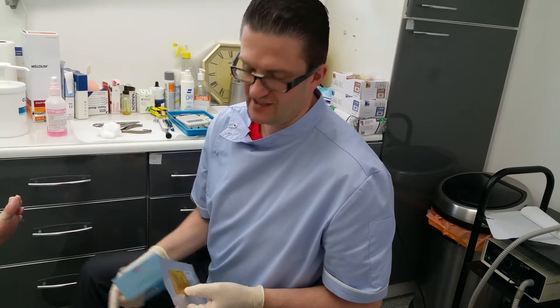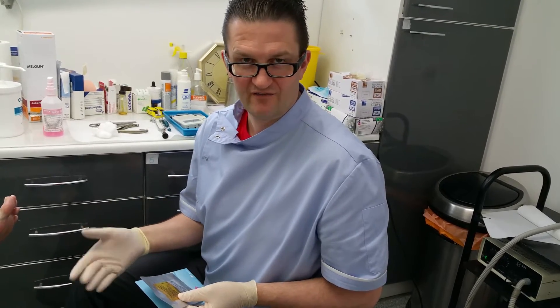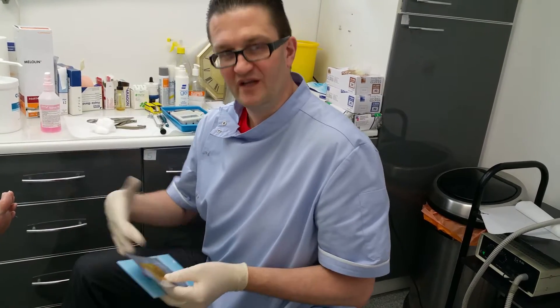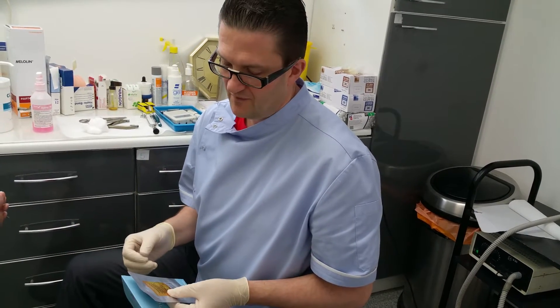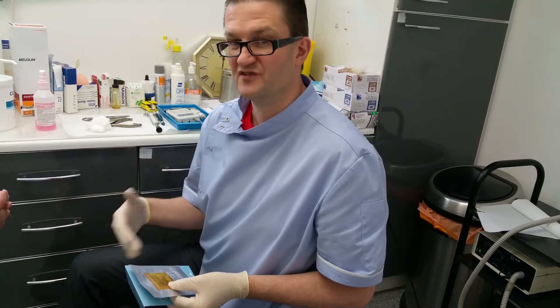There's a little pad we put on each foot and it changes colour if there is the presence of moisture. If there isn't the presence of moisture, it won't change colour, and therefore if it hasn't changed colour we know the sweat glands aren't working quite so well and the nerves have been affected. The likelihood is that this is affected by diabetes, and these nerves get affected prior to any of the other nerves which we often test for.